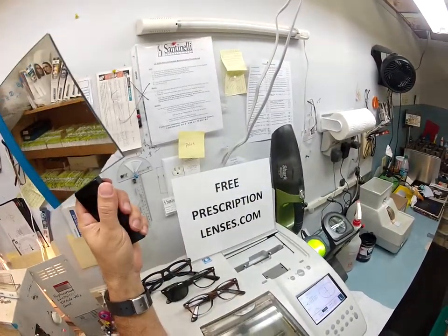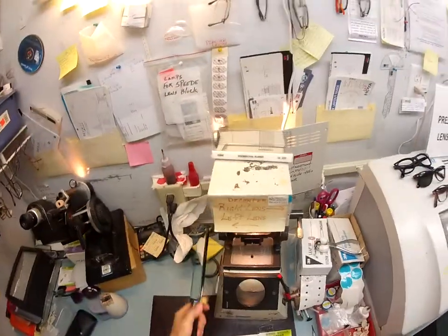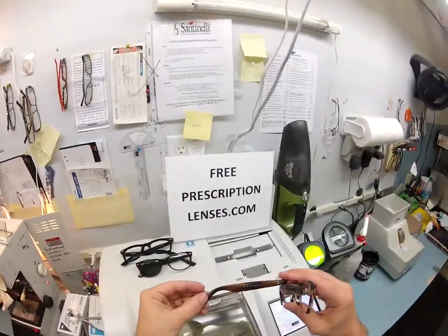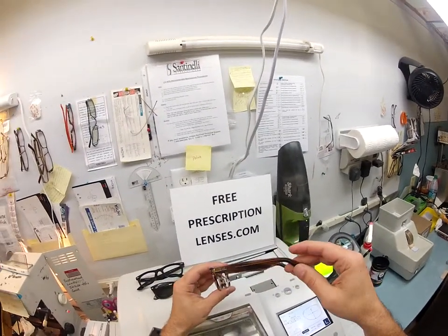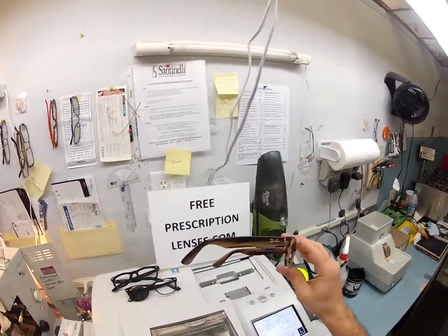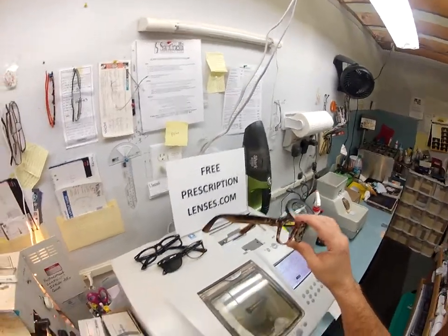Hello Mariah, Matthew here with FreePrescriptionLenses.com. With the help of my GoPro, I'm going to show you how I cut lenses for your Ray-Ban 5184 size 52. I'll be demonstrating on color 5139, which is the striped brown, but it will fit any of the 5184 colors that are available.